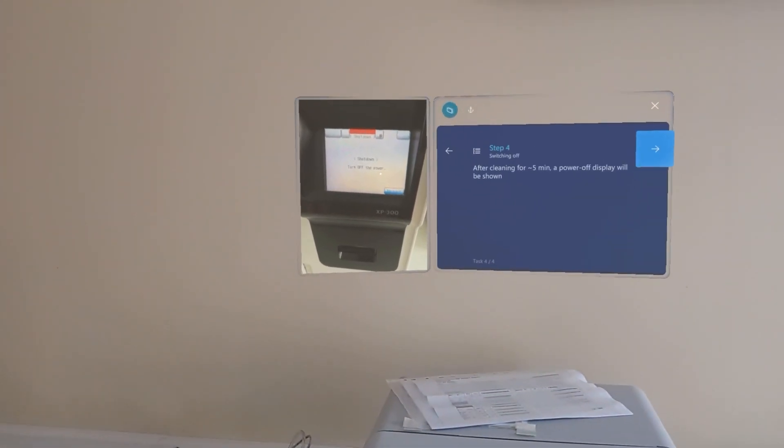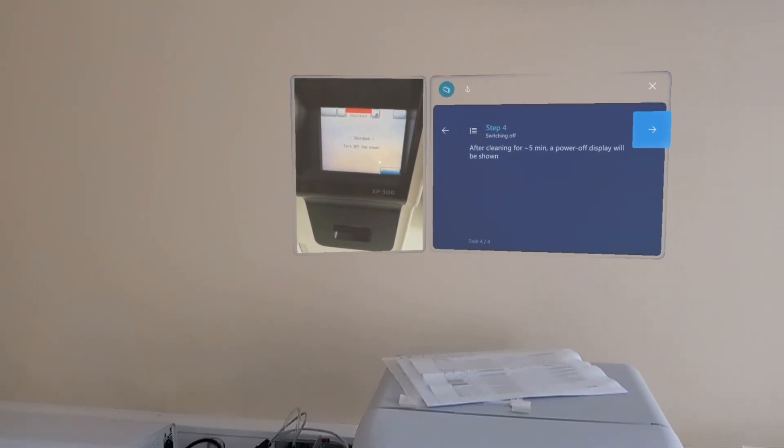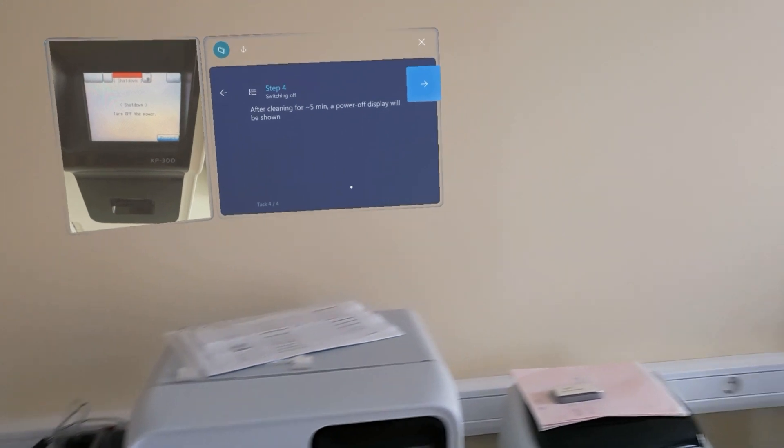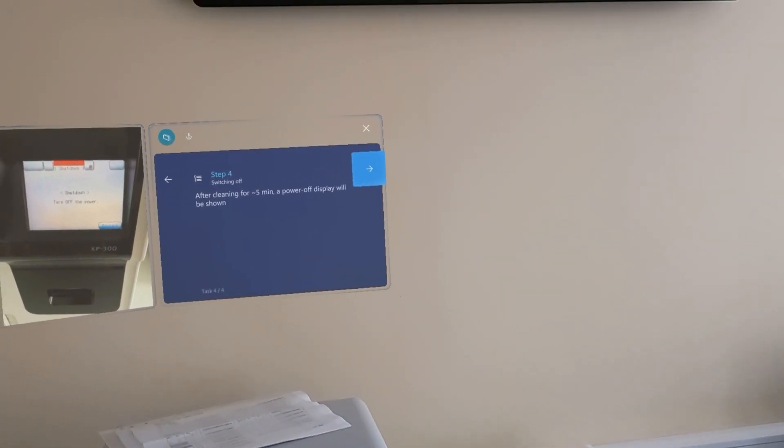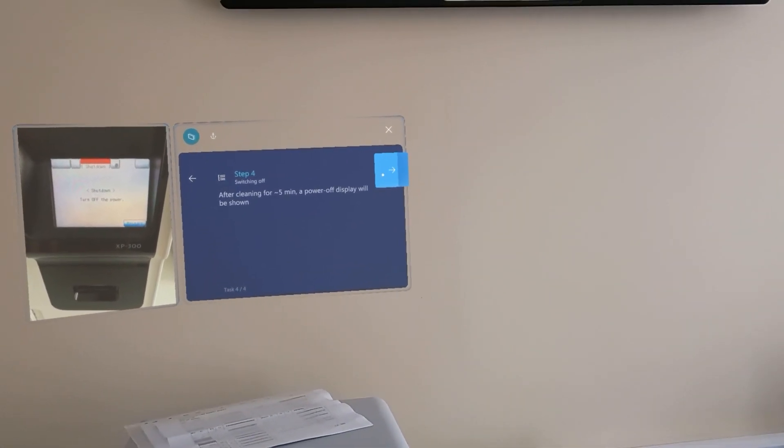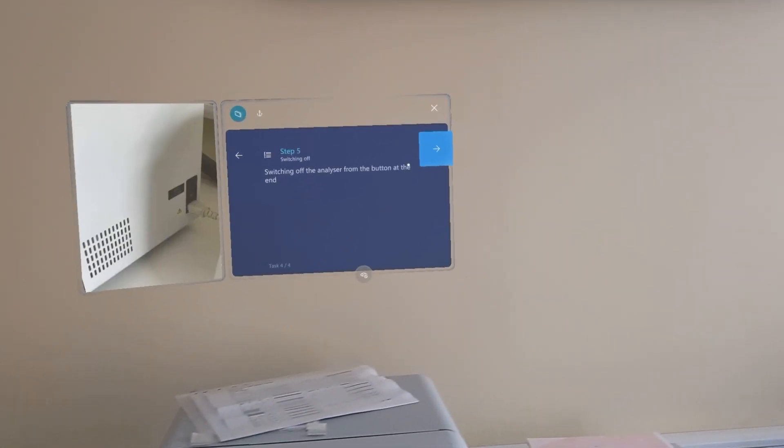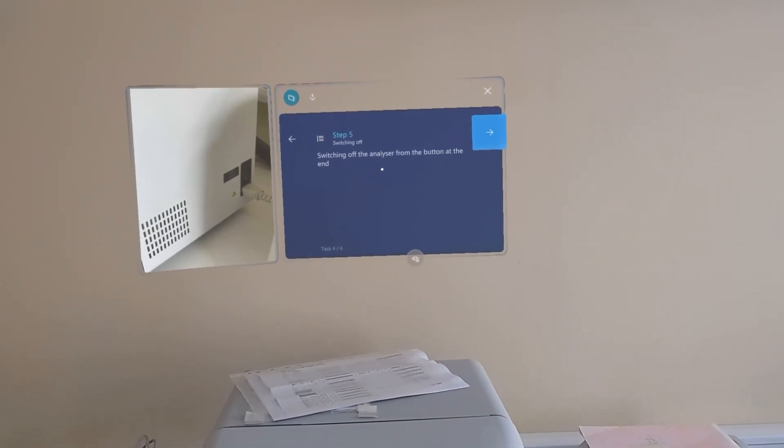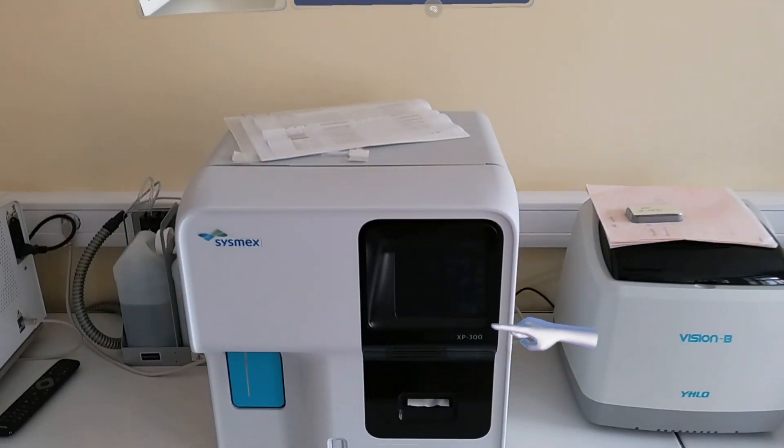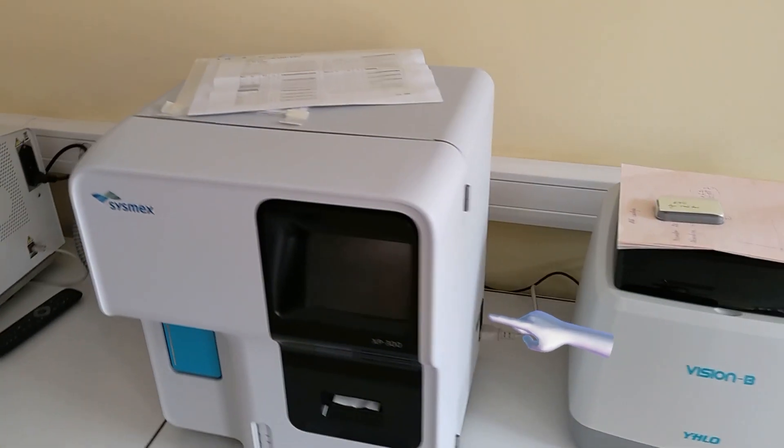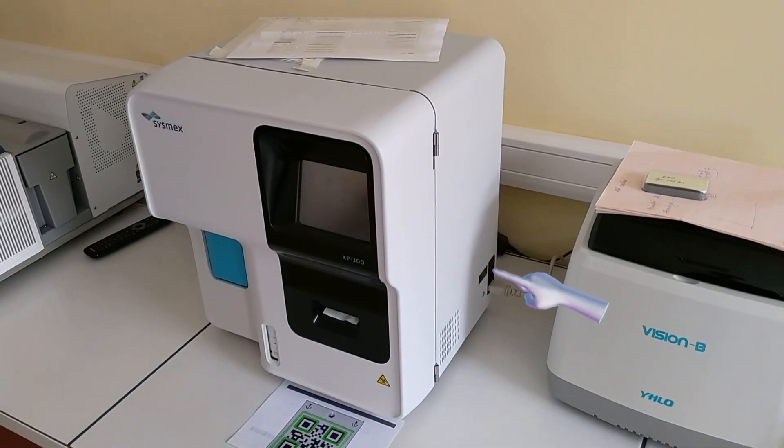After the cleaning process, a power off display will be shown. We switch it off with the button.